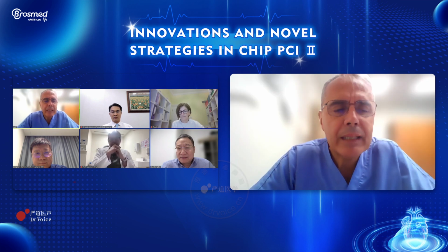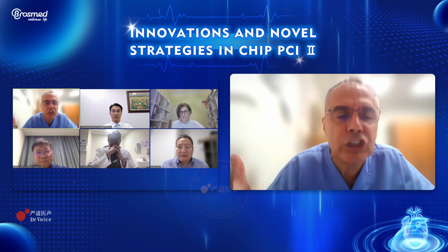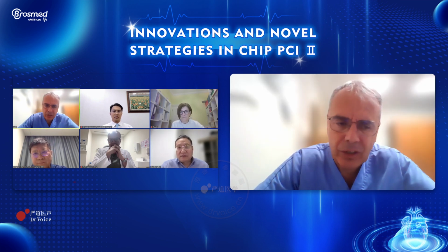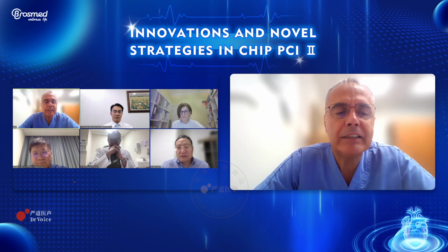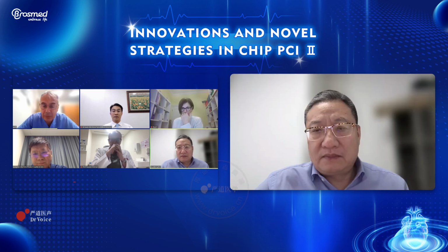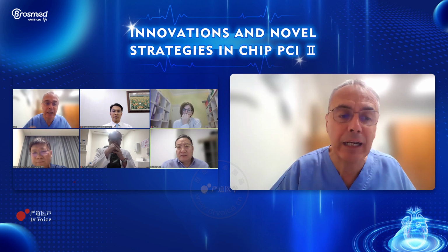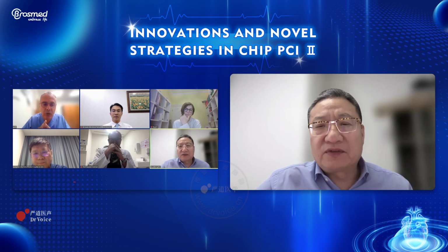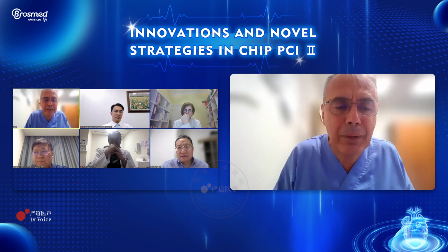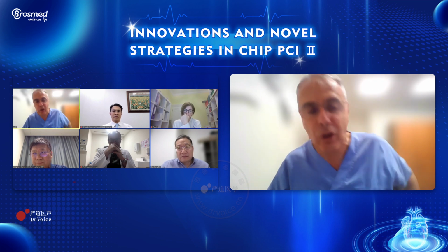Yeah. So I believe that the revo edge is, for us, very important. In Europe, we have a tradition of the cutting balloon, Wolverine, but obviously this is a different technology for two reasons. Normally, the correct use of the cutting balloon is 10, 12 atmospheres. With this technology, it's possible to go safely until 20 atmospheres, first point. Important, because if you use the cutting balloon above 12, 14, the risk of coronary perforation is not so low.